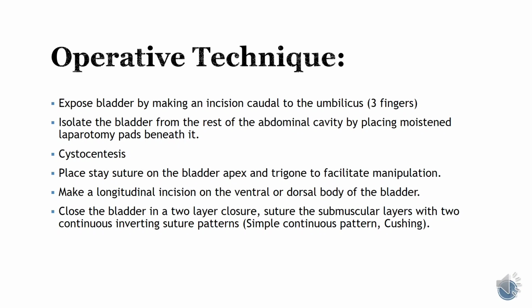we closed the bladder in a two-layer closure. We sutured the submuscular layers with 2 continuous inverting suture patterns, which are the simple continuous pattern and the Cushing pattern.